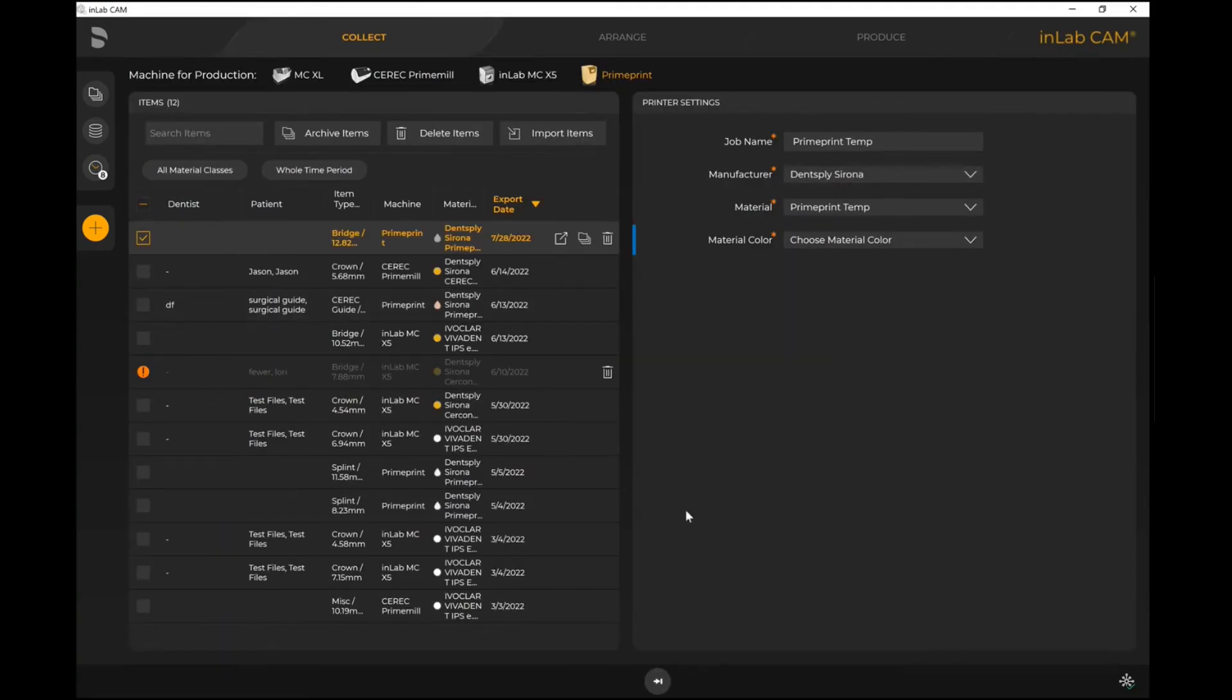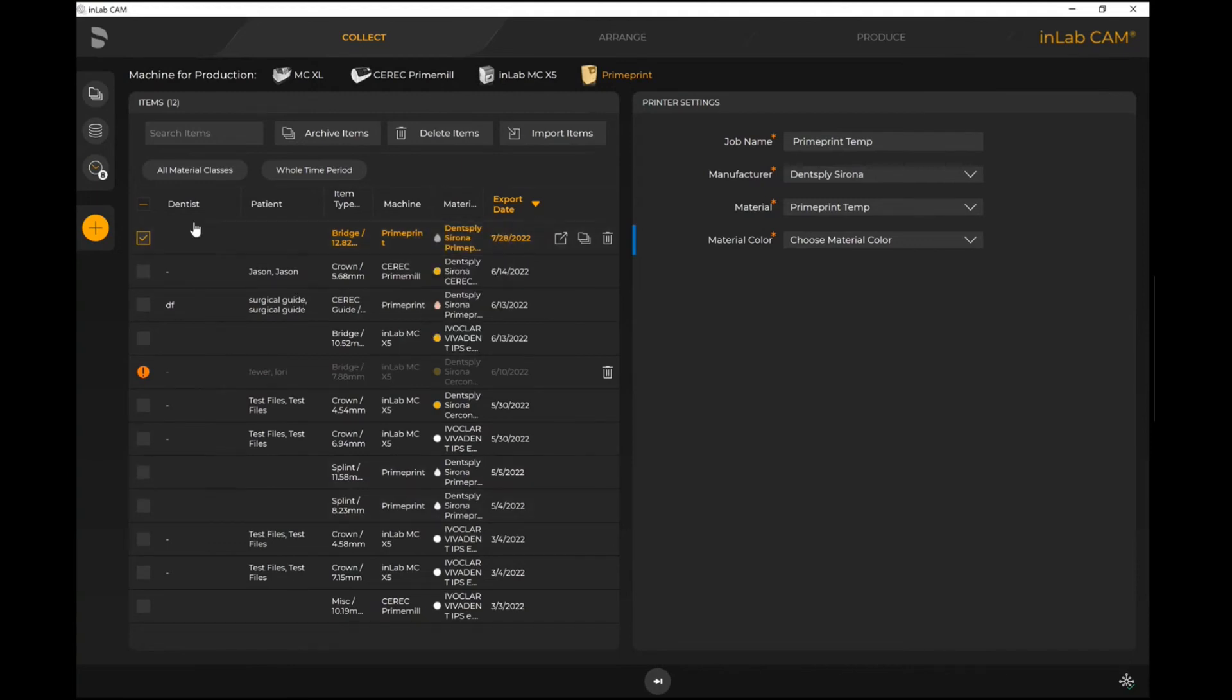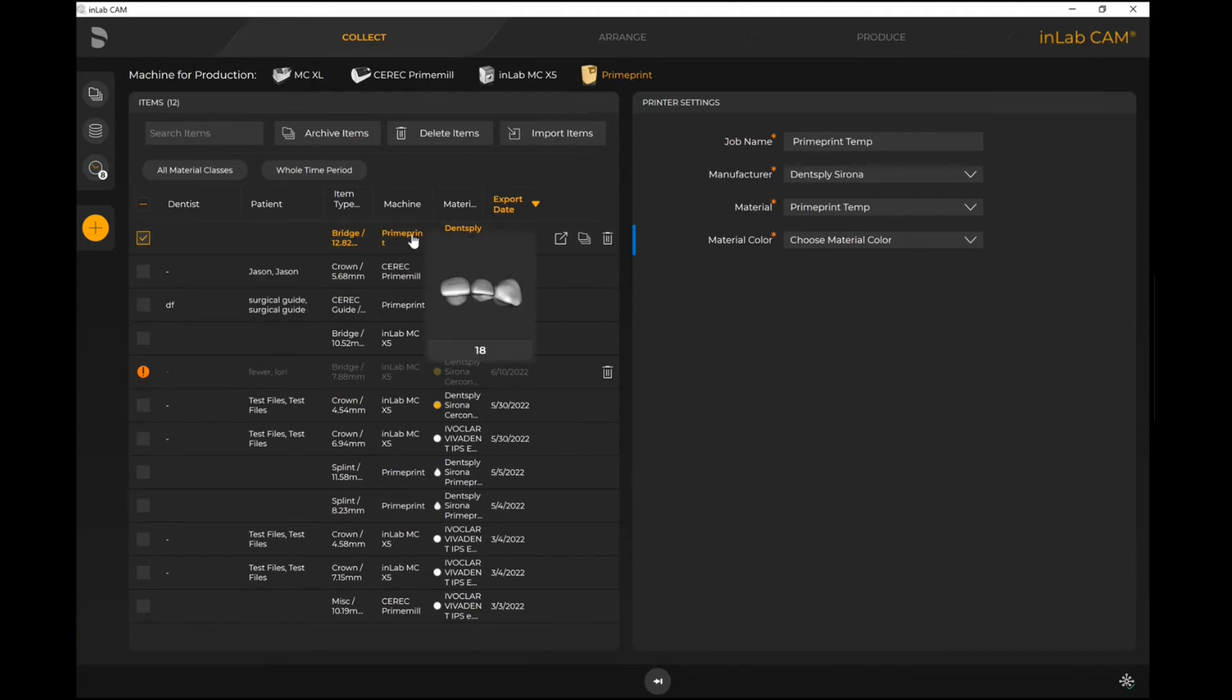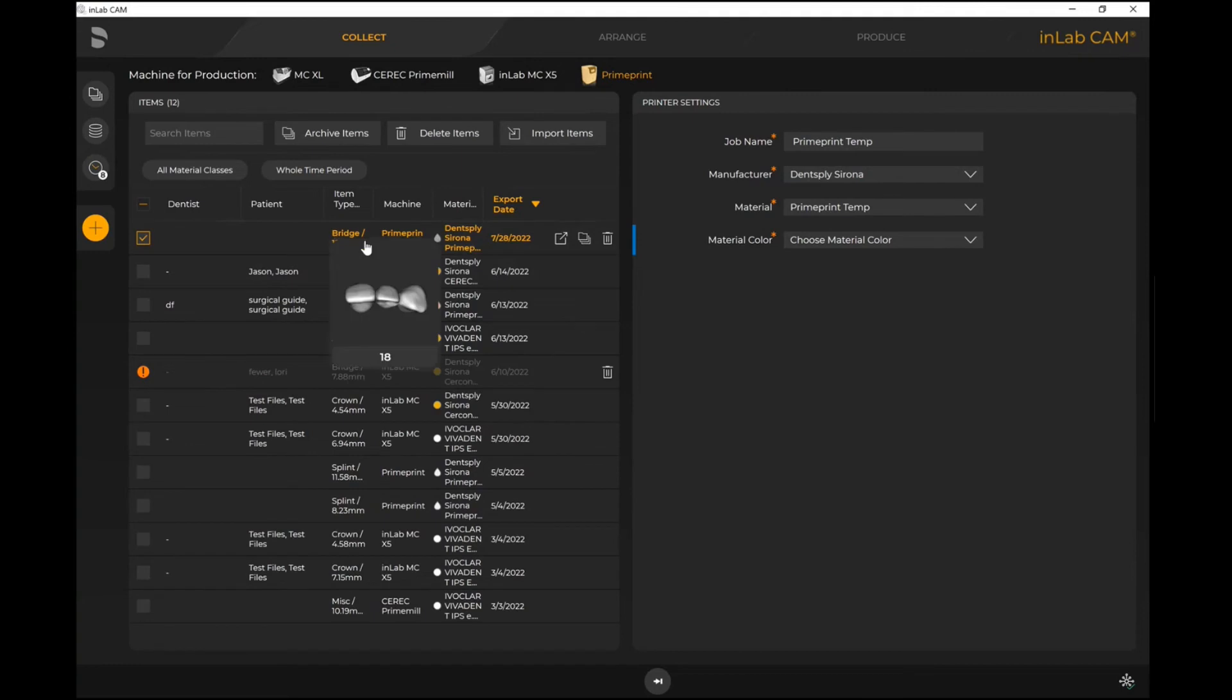Now at this point I'm ready to proceed. As soon as I'm back on this screen here, I can see all my existing files and I can see the file that I've just imported here. It now knows what machine to use, what material to use, and then of course what the actual item name was.